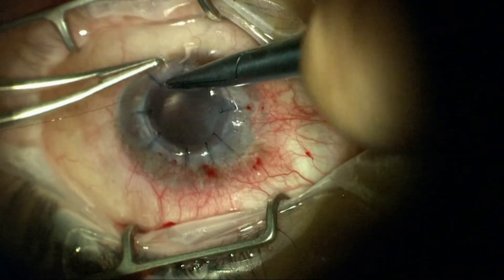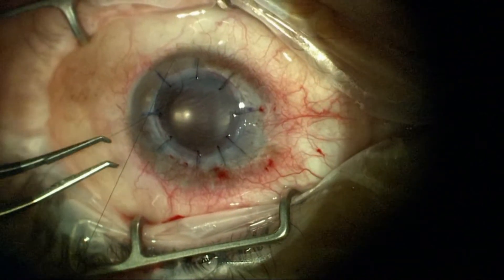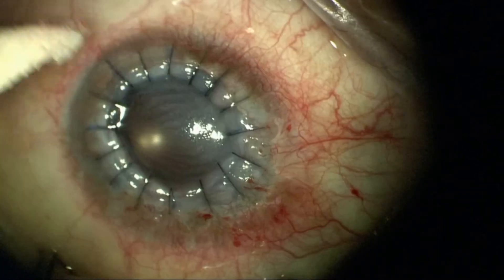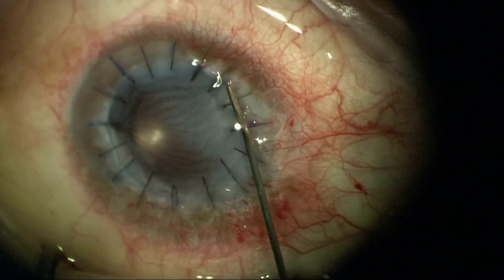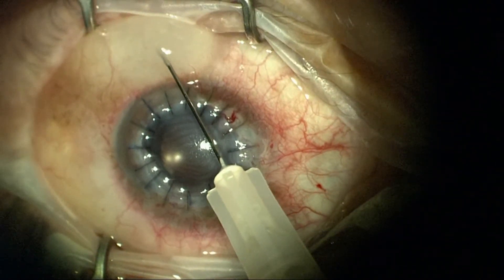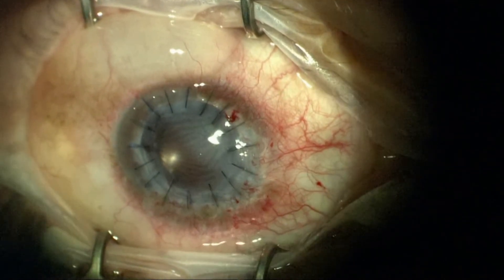We'll go ahead and put 16 interrupted sutures in place here, burying the knots at the very end again for comfort and to reduce inflammation, and also to reduce risk of infection. I'll give a combination of steroid and antibiotic injection at the end.